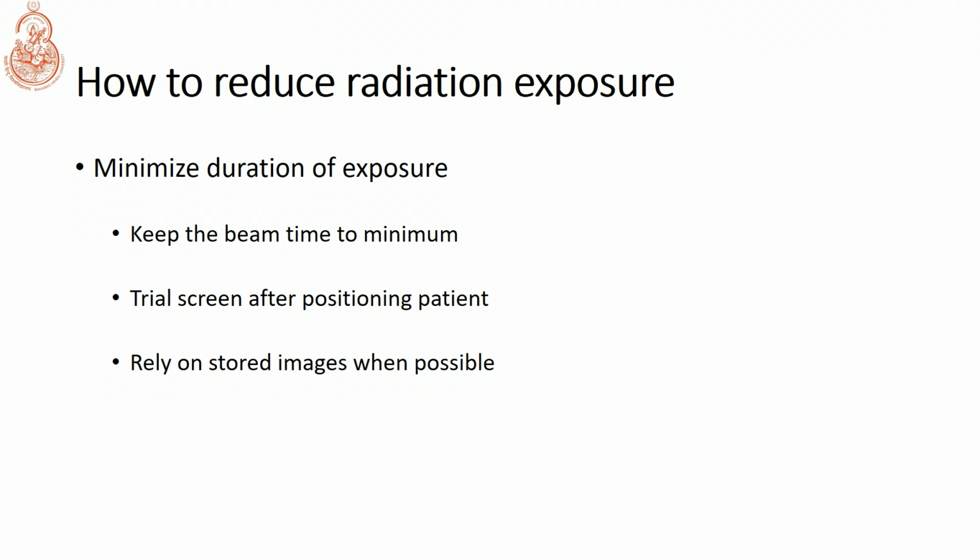What are the ways to reduce the radiation exposure? First, how to minimize the duration of exposure? Keep the beam time to a minimum. The time shall be kept as minimal as possible. Trial screen after positioning the patient, and rely on stored images whenever possible.